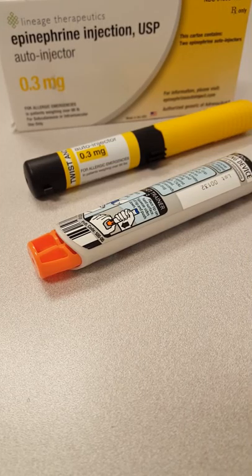Hey everyone, Jess the Nurse here. This is going to be a video on how to use an EpiPen.